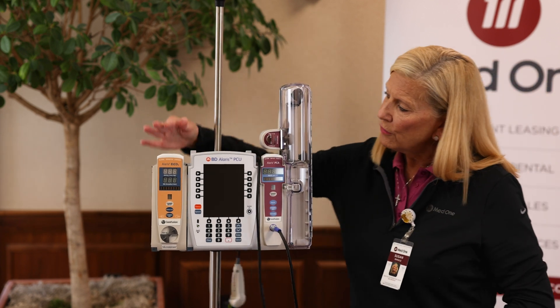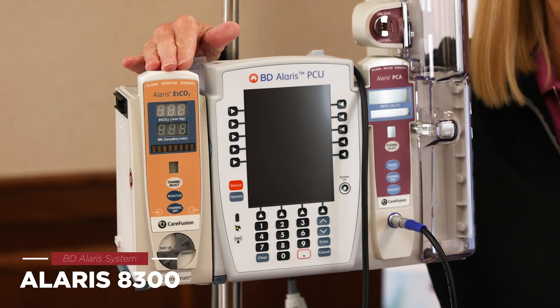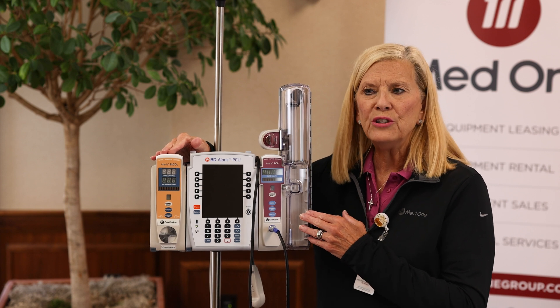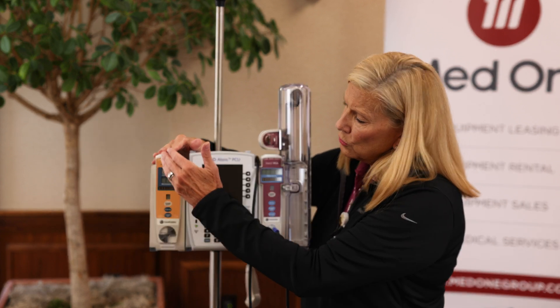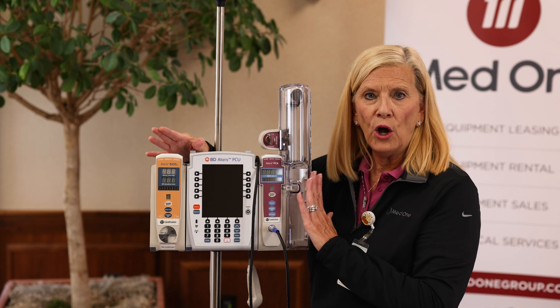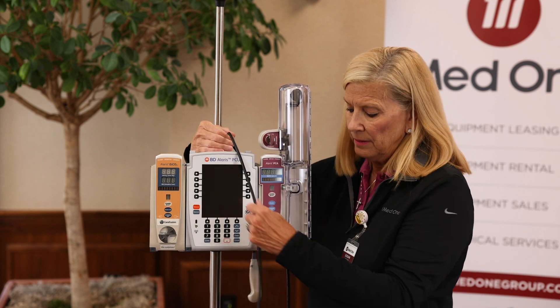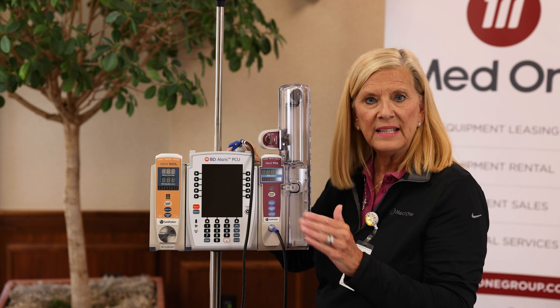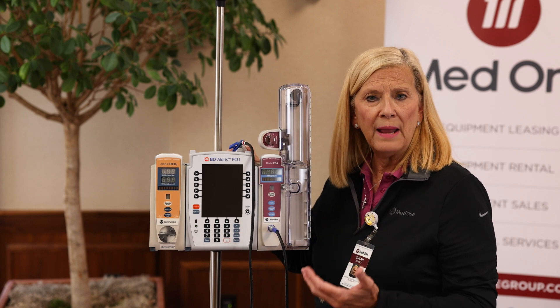Attached over here is the Alaris model 8300, the EtCO2 module. When used with the PCA, it provides an extra layer of safety should the patient's respiratory rate get dangerously low. When the rates drop below the programmed settings in the EtCO2 module, the pump will alarm, the PCA medications will stop infusing, and the button the patient uses will stop working as well. That way the nurse can come in, assess the patient, and take whatever actions are needed to get the patient breathing much better and more efficiently.